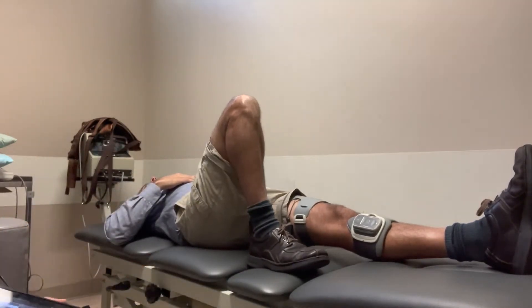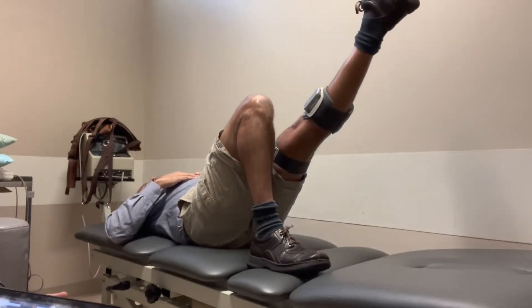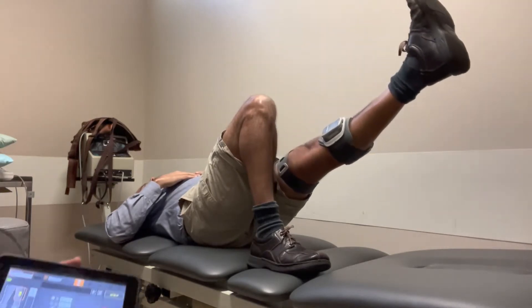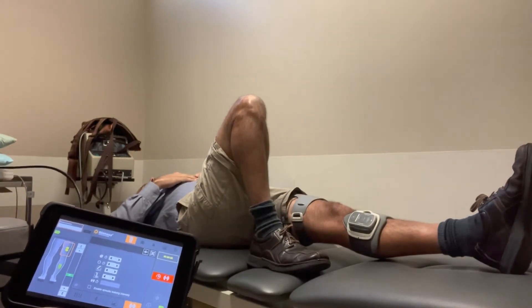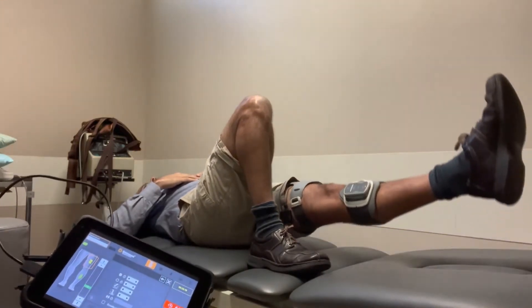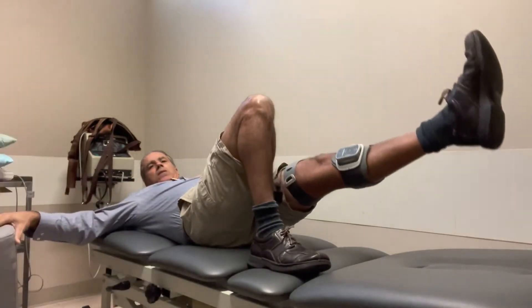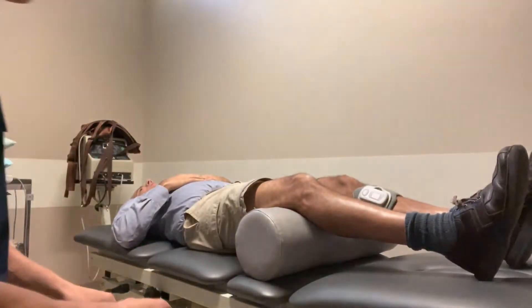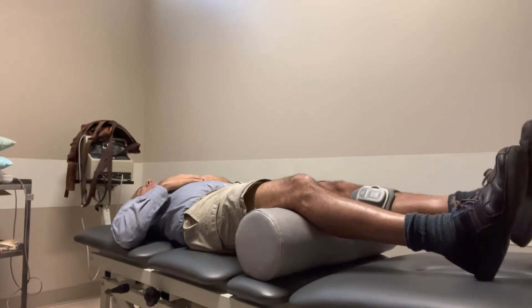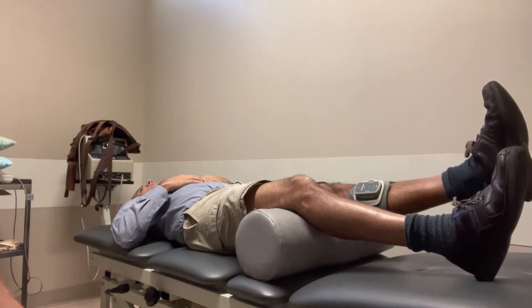Next we will do a straight leg raise — so next time he feels the stimulation he performs the movement. As a reminder, the training time can be set all the way to 20 seconds for the on-time if you want the patient to pump out more reps in a shorter period of time. Every time he feels the stimulation, he goes into that quadriceps contraction.